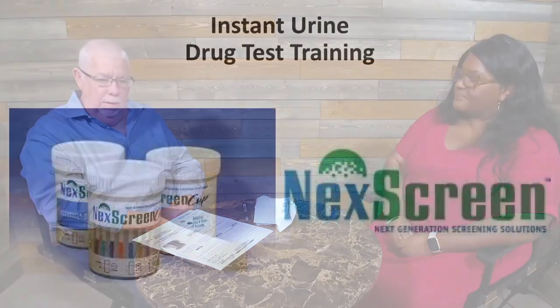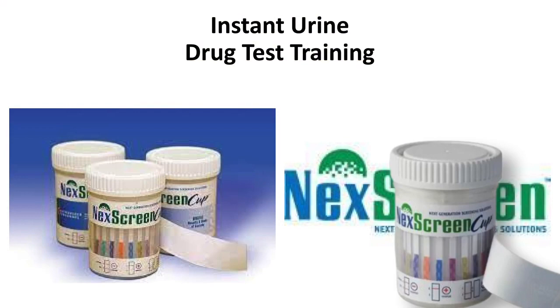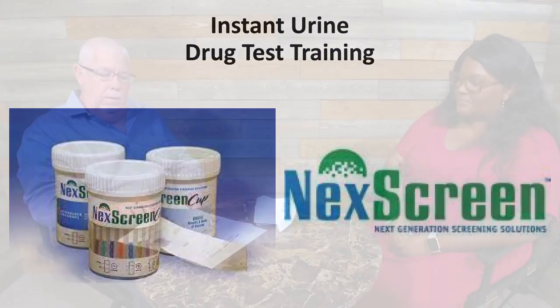This is the instant Next Screen cup with urine for a drug test. We have a Next Screen donor consent label form — for those of you that might be doing the collection electronically on your computer, you can also use a manual paper form if you're not using electronic. We also have a custody and control form; if you're not doing electronic, you would fill out a custody and control form for when the specimen has to go to the lab for confirmation testing. With that, we're going to start the demonstration of the collection process.